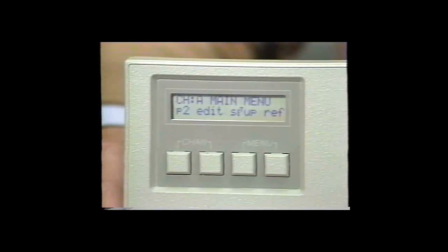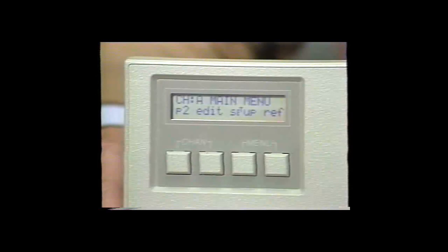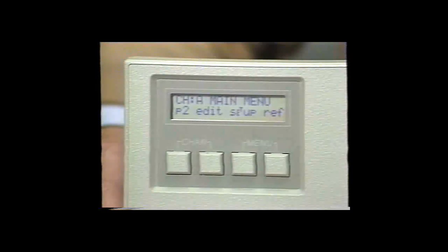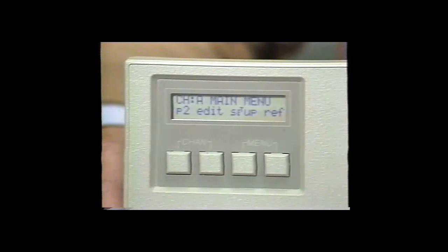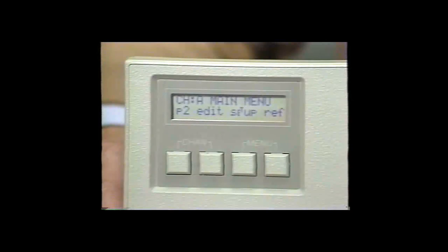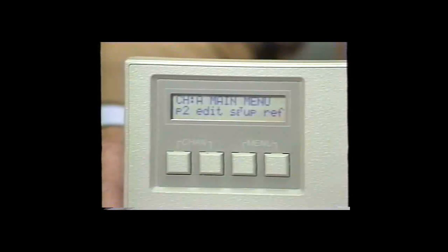Edit also gives you access to the channel copy mode, which will allow you to copy one channel format to the next. Setup is used to set the I/O parameters so the densitometer will communicate properly with a printer or a computer. It is also used to set the time and date and enter the name of the hospital or institution. Reference is used to automatically enter your reference data to give you actual limits on your processing conditions.